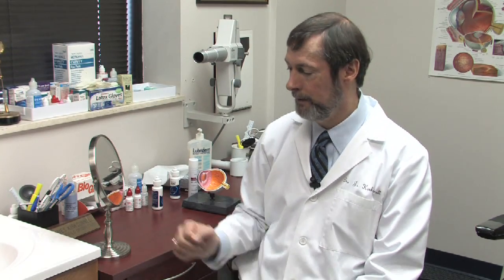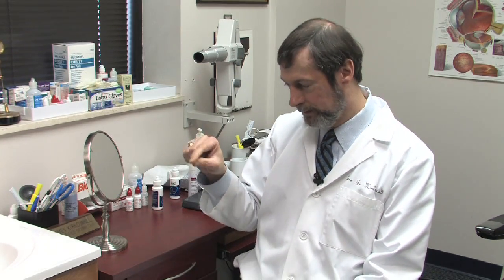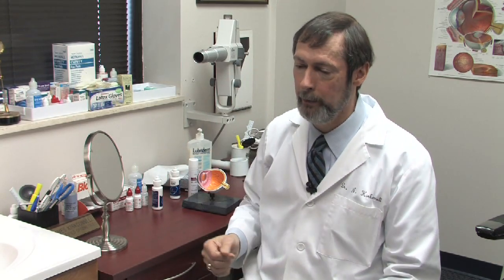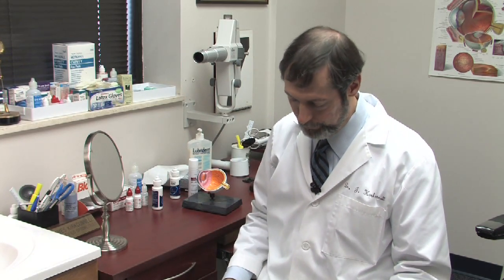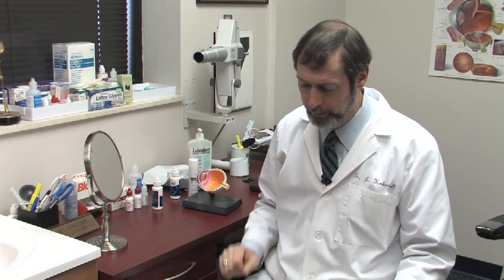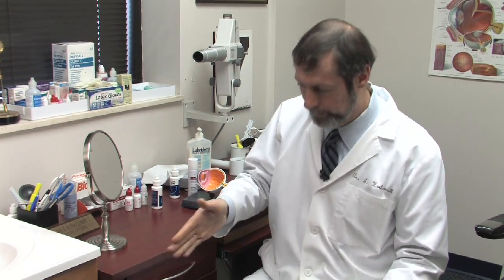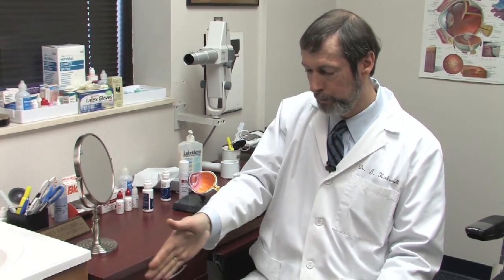Now, there's a second type of contact lens which is still fit and that's the rigid gas permeable. That is less than half a percent of what I fit today, but those are different because they're like small tiddlywinks which are smaller than your cornea. The way that is taken out is a person does better if he or she is looking down and then you look 20 degrees towards your nose.